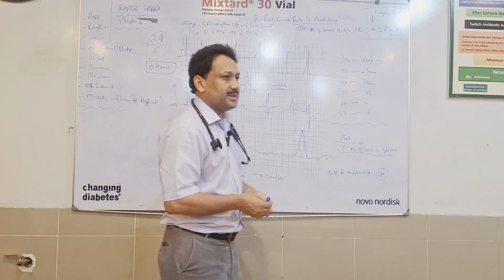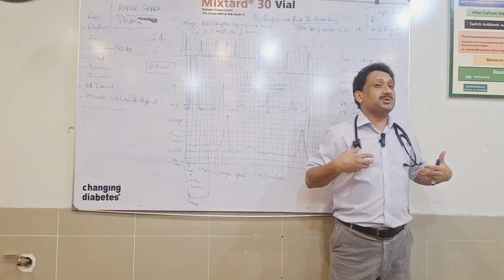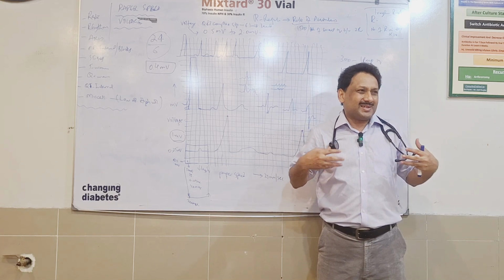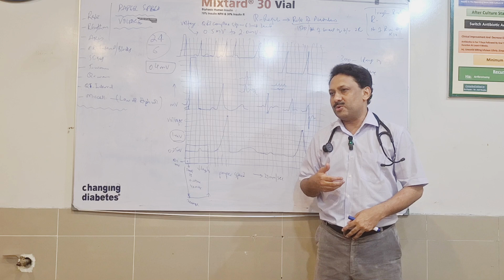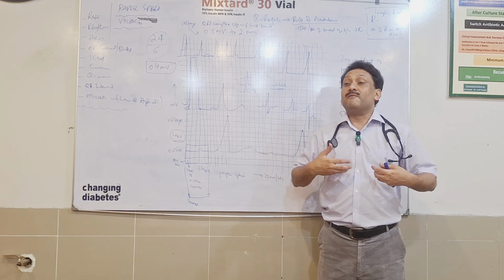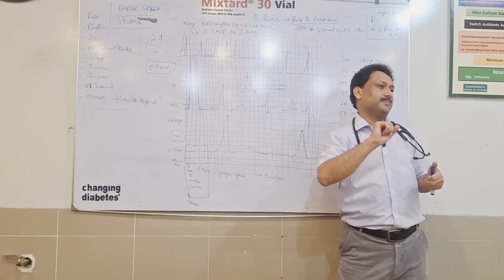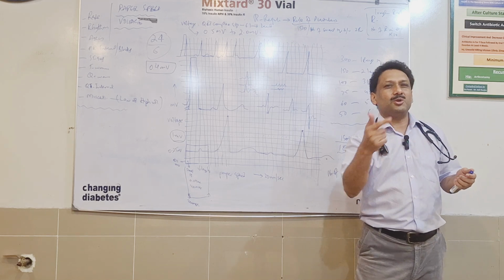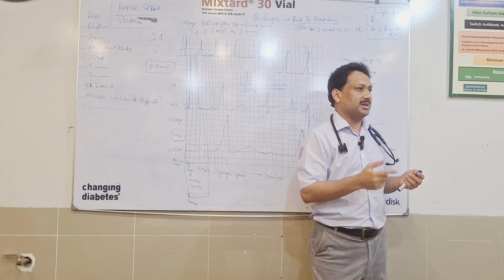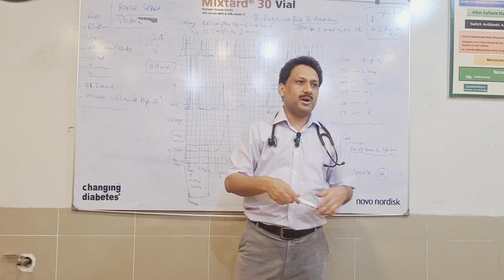So in which situations can we have low voltage ECG? The answer is very simple. How is the voltage measured? We place the electrodes on the heart. If we bring something between the heart and those electrodes, like pericardial effusion, if a person has massive pericardial effusion, will the current reach those electrodes the same way? No. There will be low voltage. So if somebody asks which things would lead to low voltage, your answer should be, sir, pericardial effusion. Any other example? Again, in tamponade, the problem is the same.